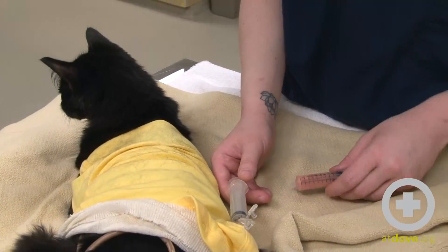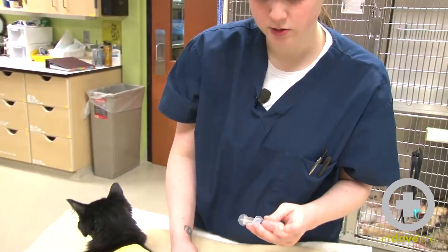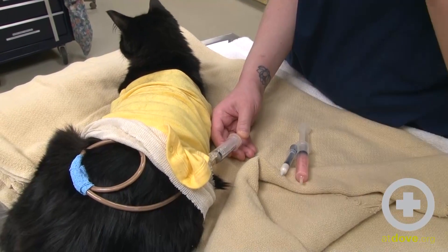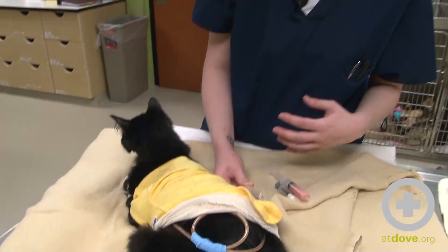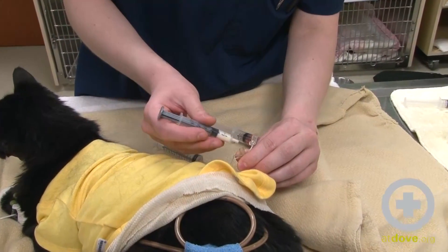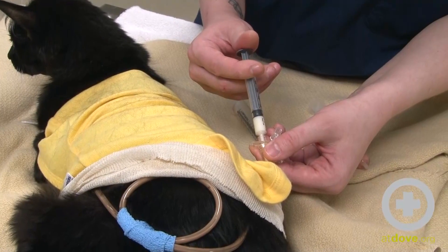I've just finished the feedings. Half of the feeding volume is still within the tube as we discussed, but the volume is in there. I'm going to now give her medications via her PEG tube. This is really nice for a cat, especially in her condition, that might be hard to give medications to anyway. With all the trauma to her cervical area, it's good to not have to fight with her or do any more trauma to that area by trying to get pills in her if she's unwilling to eat. I'll disconnect the syringe of food and connect the first medication, the Clavamox. I still want to push it slowly because I have to remember I'm still pushing the food through there before the medication gets there.